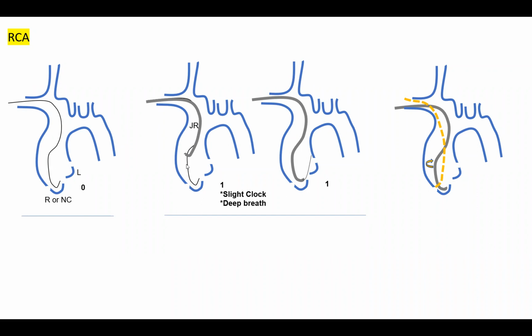So you advance it and make it fall onto the right coronary cusp, looking this way, over the wire, and you reach that base of operation, the aortic valve coronary cusp. After that, in this case, you can pull the wire, unlike with the left coronary engagement. You can pull the wire, then you pull with a 90 to 180 degree clockwise maneuver to engage.